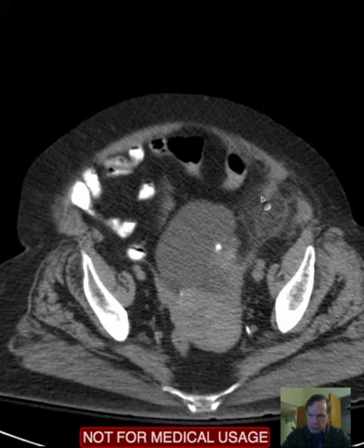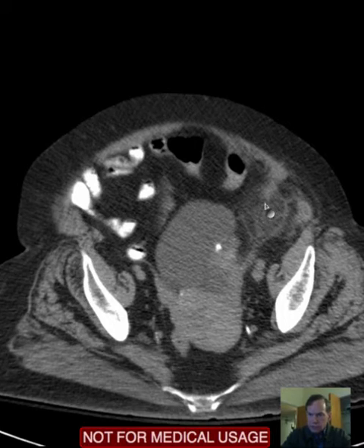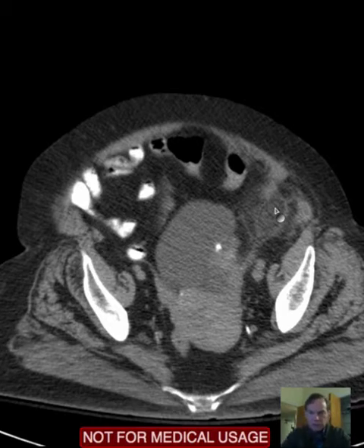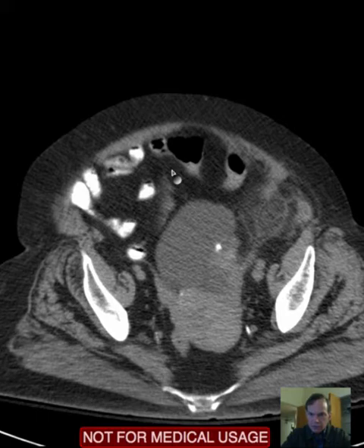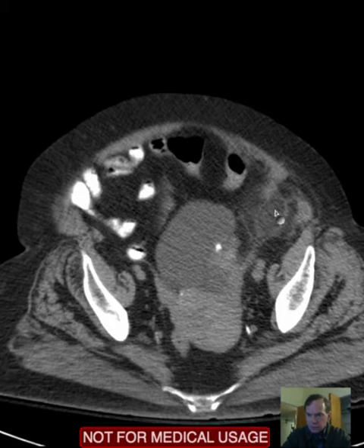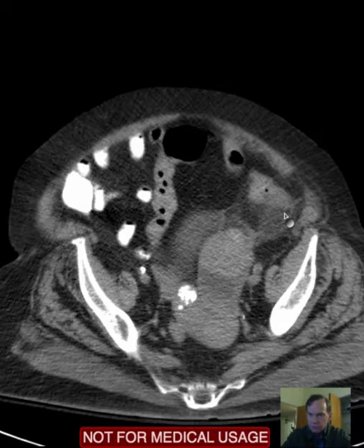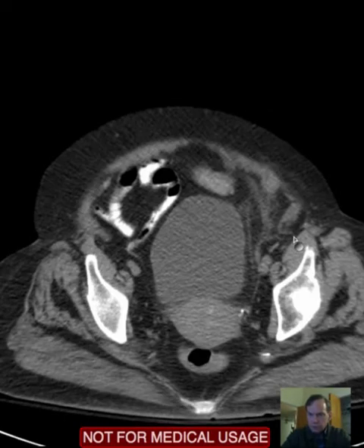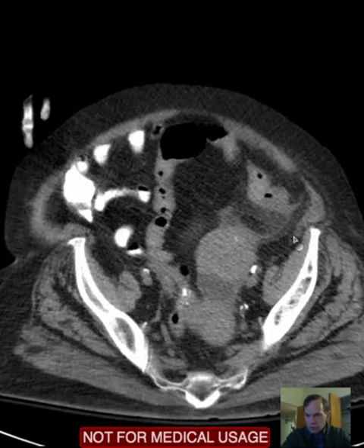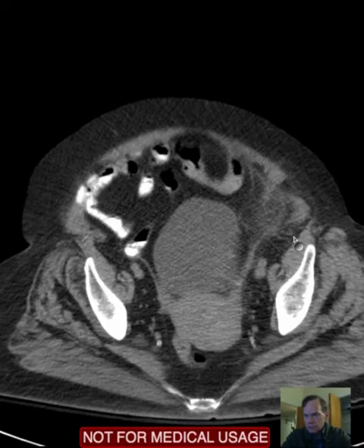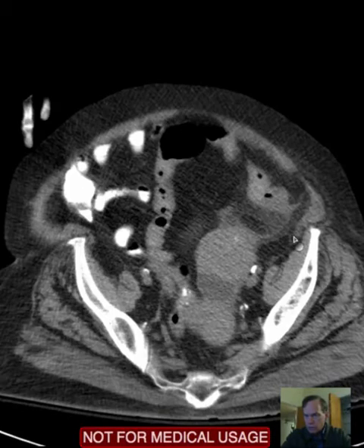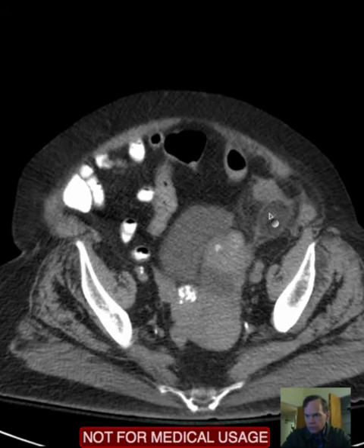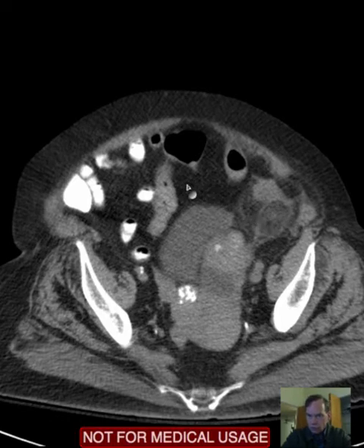What we see is in this left lower quadrant stranding. Stranding means little linear areas of opacity, typically in the fat. So if you look here, you have nice, pretty homogeneous dark fat. Here it's all lightened and there's a strandy, stringy, linear pattern in this area — that's what we refer to as stranding. Objectively, it is generalized increased attenuation of the tissues, meaning there's a higher attenuation in these tissues than in the normal fat.